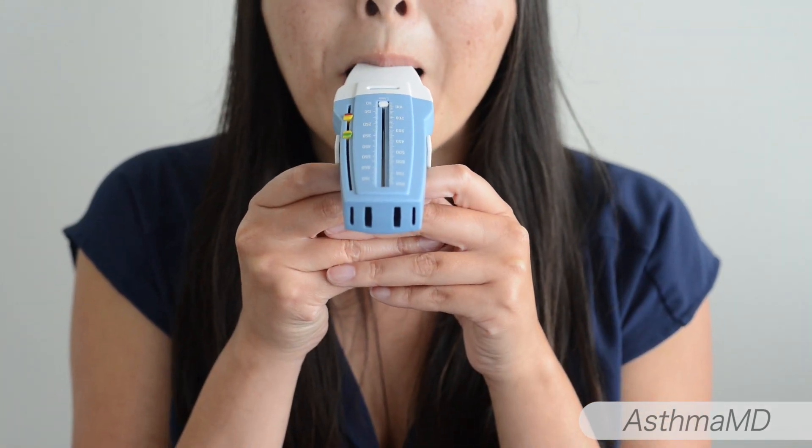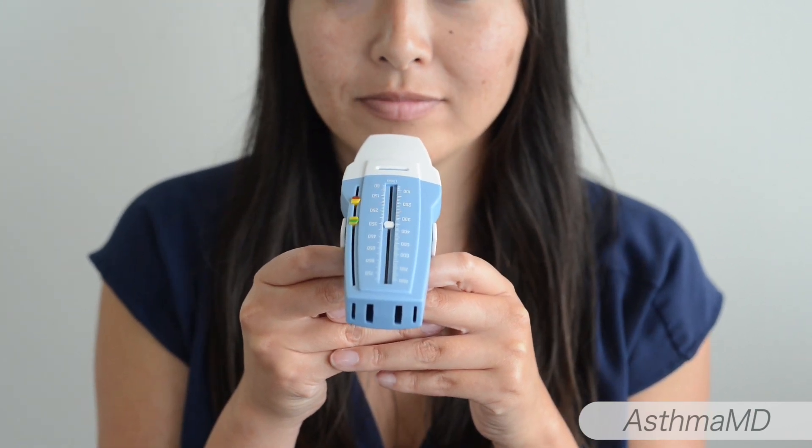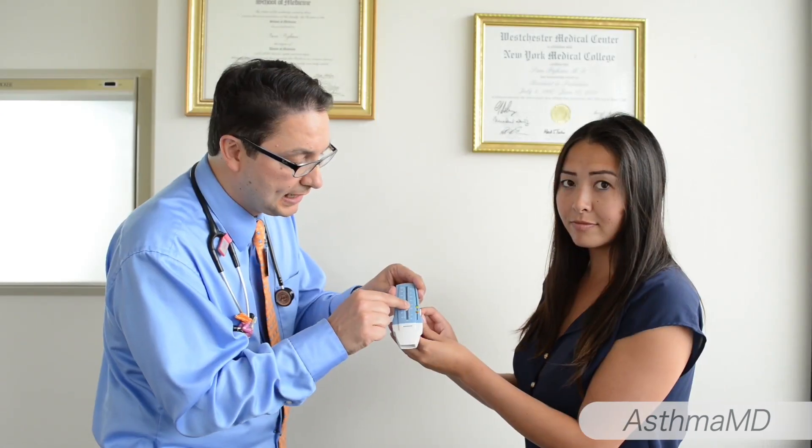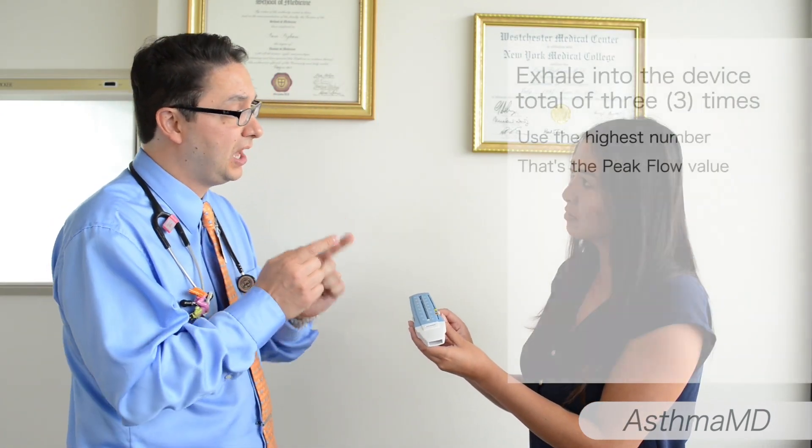Let's go ahead and start using it. Open the handle and hold the device by its handle. Hold it horizontally, and when you're ready, take a nice deep breath in and blow into the device as fast as you can. The white slider moved. We're going to move it back to the base and repeat the process two more times, recording the highest number.